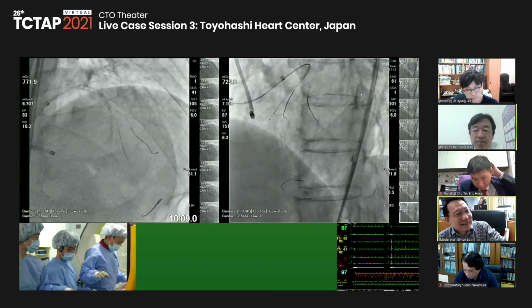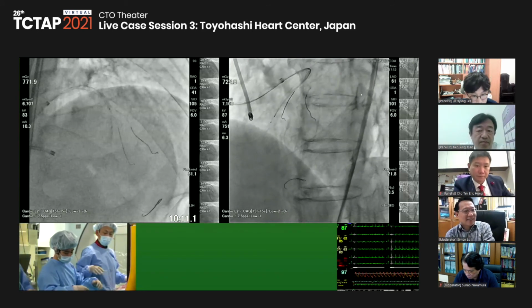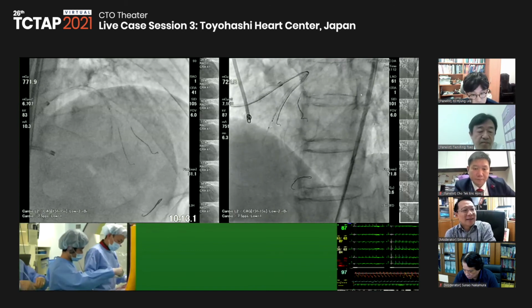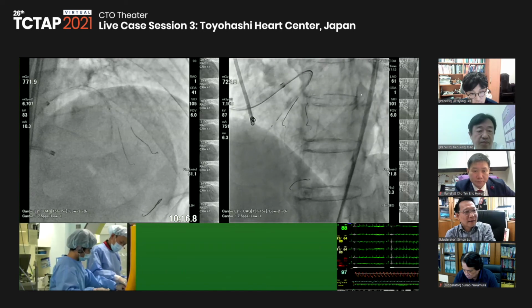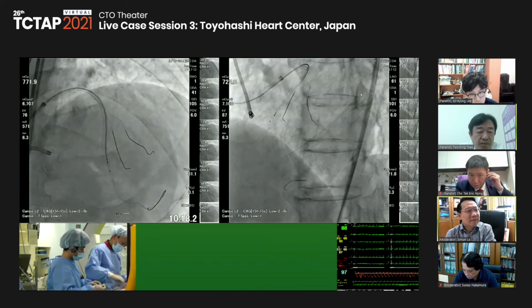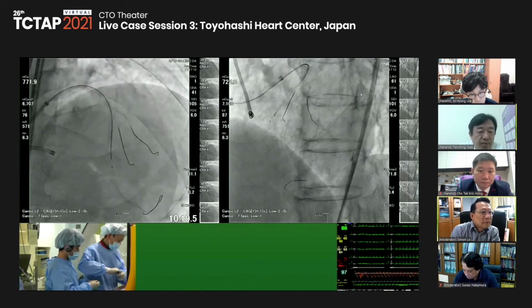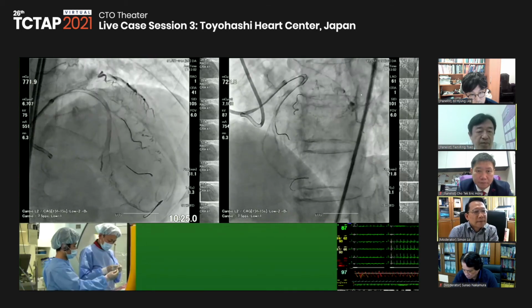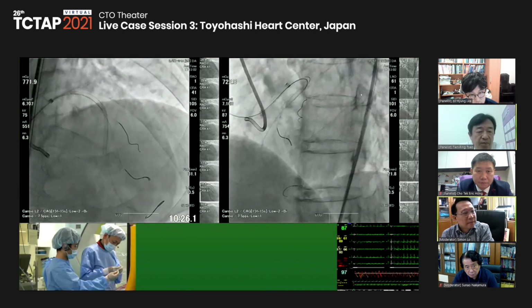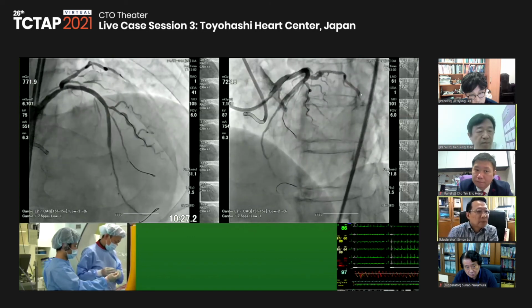Uh-huh. So I will use a 3.0 and a 2.5 for the final kissing inflation. And then maybe the final POT dilatation by 3.5 or 3.75 or something, according to the IVUS findings. Okay.